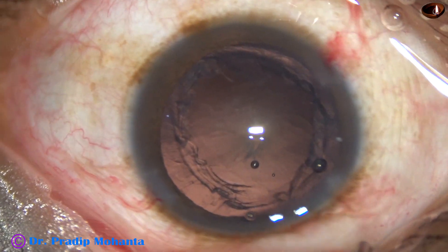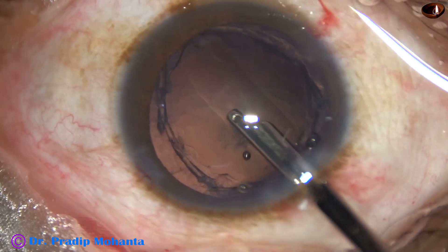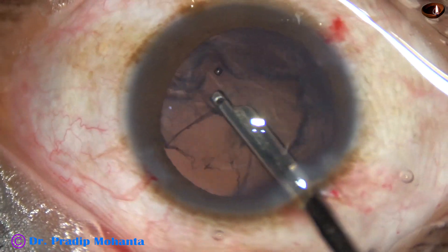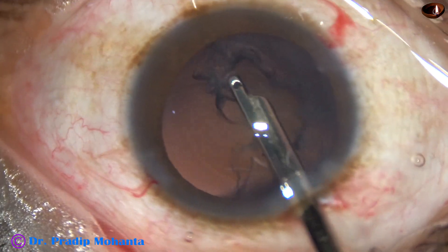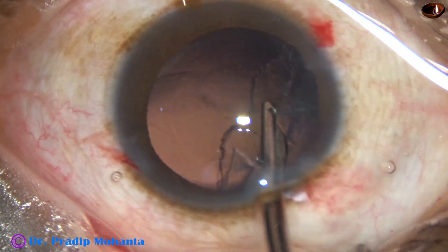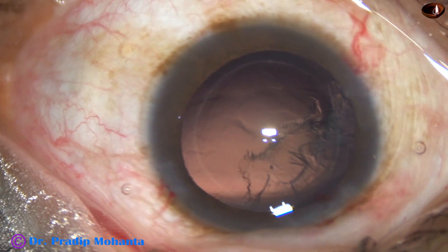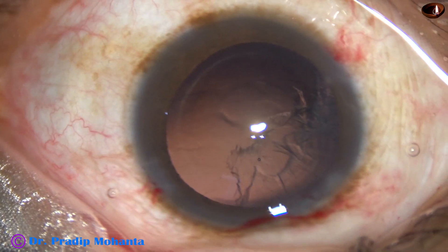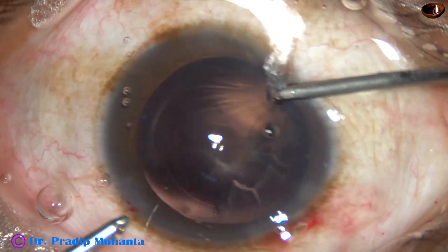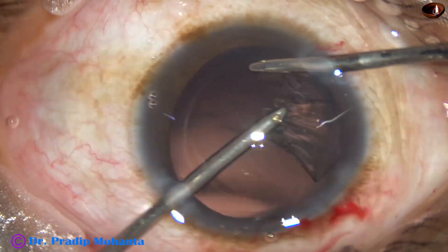Now this epinucleus and cortical matter is to be removed. By the time my assistant is getting ready with bimanual irrigation-aspiration, I am using a 23-gauge Simcoe. Now I introduce the irrigation from the right side, aspiration from the left, and remove this cortex.